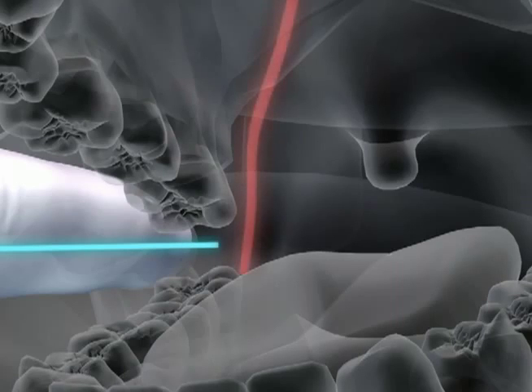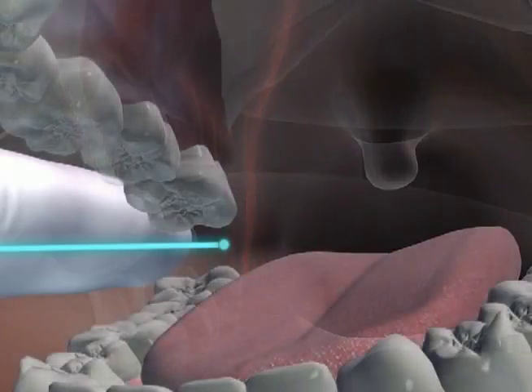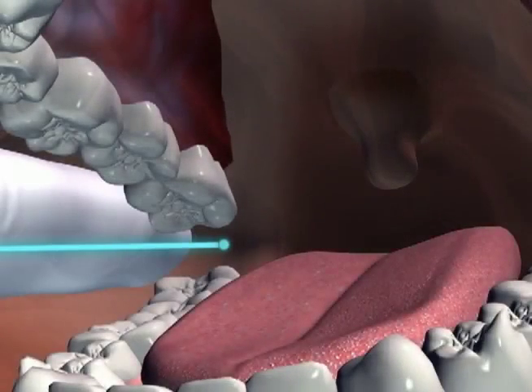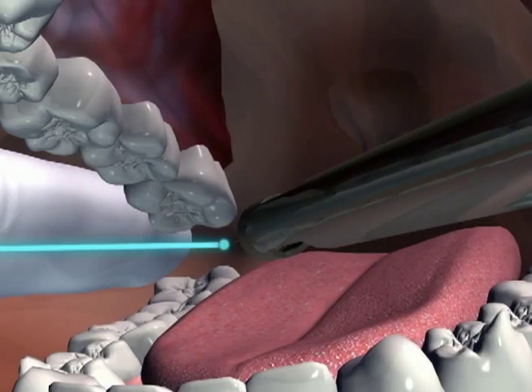The operator should visualize the pterygomandibular raphe and the deep tendon of temporalis under the finger as forming a triangular area under the pterygomandibular depression. Positioning the syringe over the premolar teeth on the opposite side and just above the plane of occlusion, the needle is placed at the insertion point within the depression, about 1/4 to 1/2 the distance from the raphe to the finger.